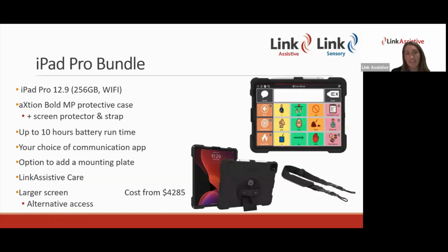So that's the iPad Pro, where you can again choose the communication app required, and it comes in a different case, which doesn't have the speakers, but it adds durability and it can be mounted as well. So it means that it can be made accessible and positioned nice and safely.